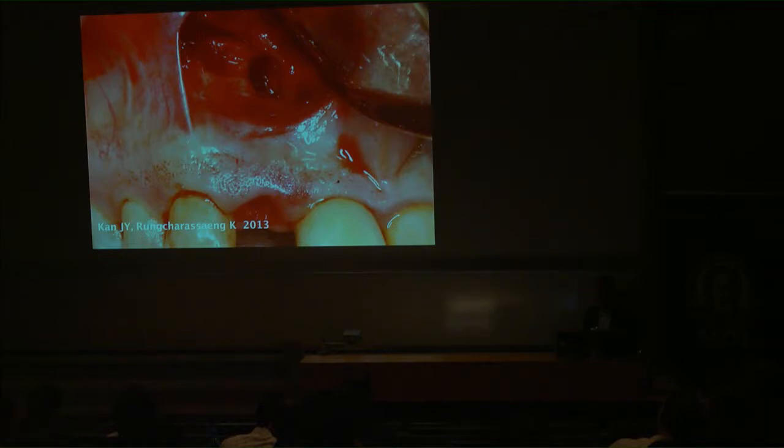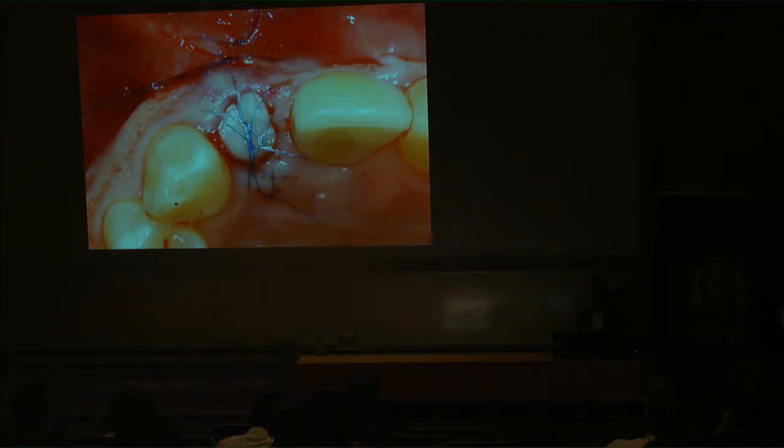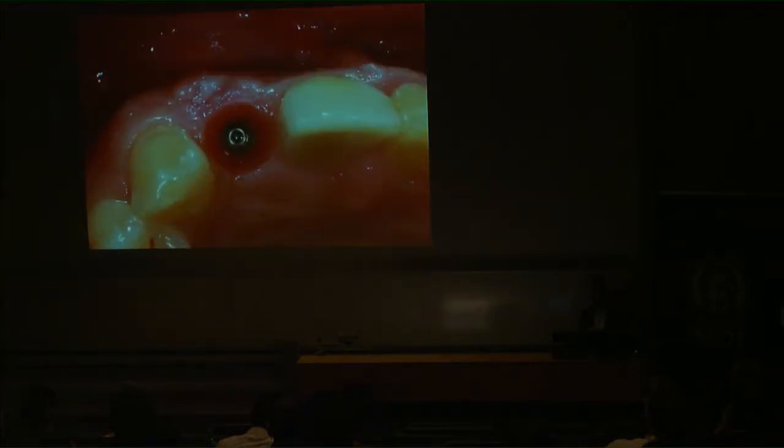Nowadays, I'm not so sure if the proximal shield is necessary to maintain the inter-implant soft tissue, as observed in the previous case. I didn't have enough torque. Socket seal graft was performed. At 4 months post-op, the scar tissue was due to a lousy second stage surgery. I had offered to do a gingivoplasty, but the patient didn't think it's necessary. So I left it there to remind me of my poor planning.